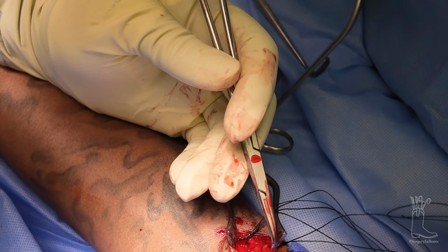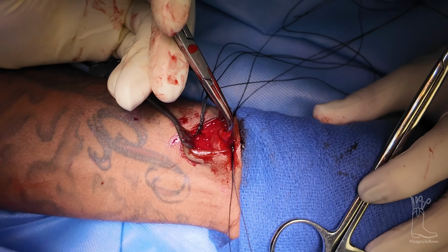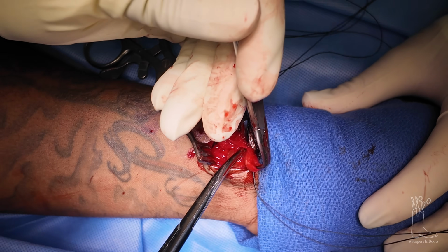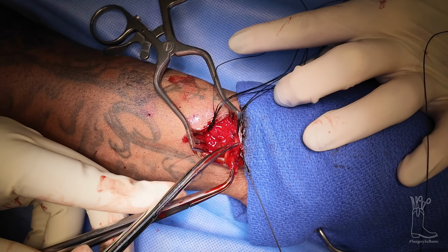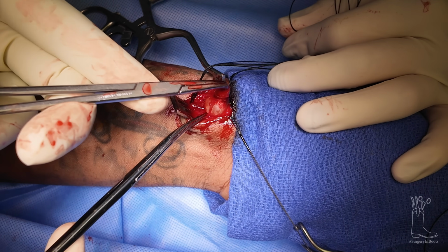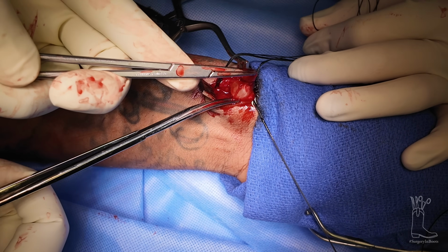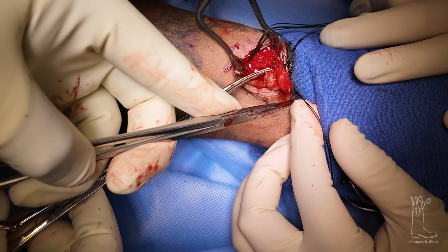So back to our regularly scheduled program. What we're seeing here is actually pretty cool. I'll get another one in a second. So what's happened is you can see here's his ganglion cyst. So he actually had 2 problems. He had a ganglion cyst, and he also had this aneurysm that probably resulted from a fall. That's why it was getting bigger and smaller, because of the aneurysm. But when we tried to aspirate it, we got a lot of blood because of the aneurysm.